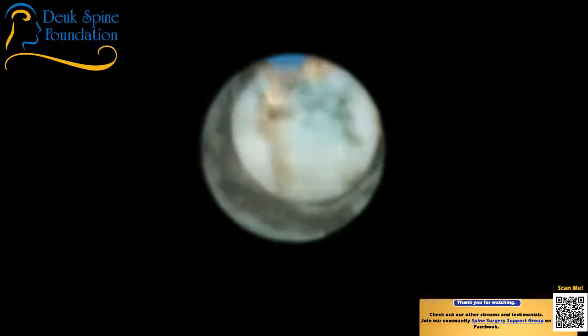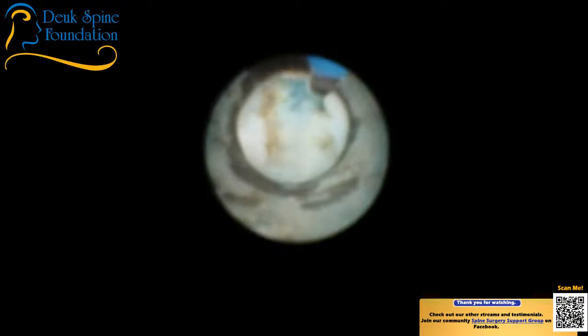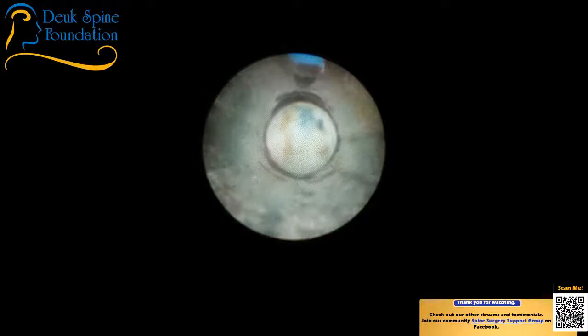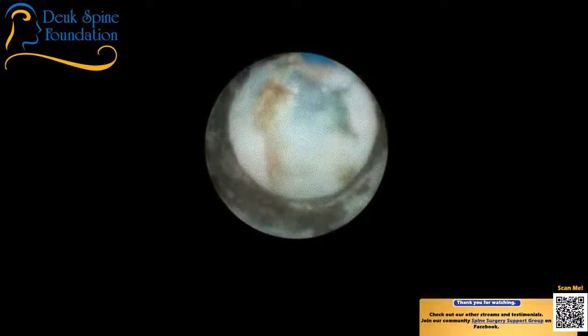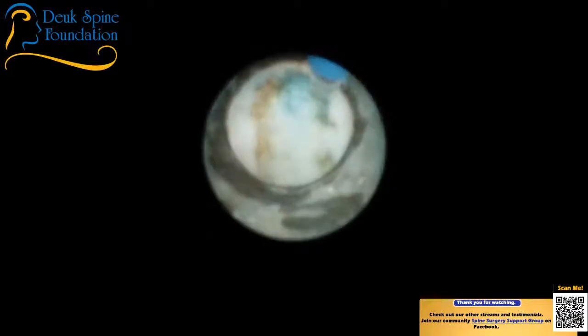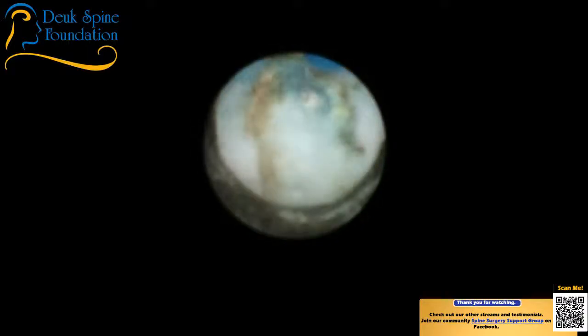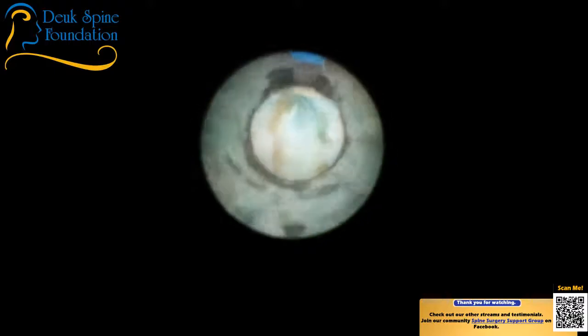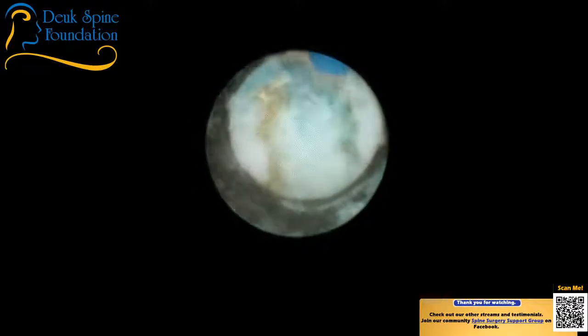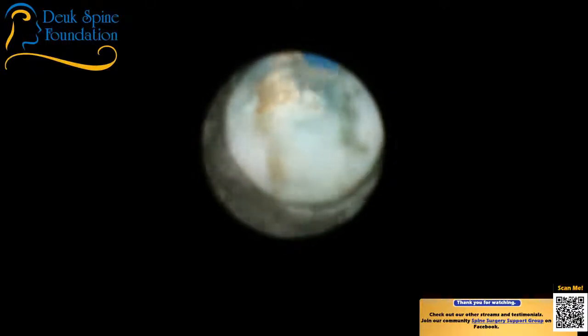Interesting. This scope will need to be repaired, I think. What happened? Because the fibers are moving, they're distorting the image. See? I mean, we're okay. Actually, I think we're okay. There is some play. So the adhesive molecules, you see how when I bend it a little, it changes the focus? Yes, sir. So that may be that the glue that holds the fiber optic fibers in place just needs to be redone.